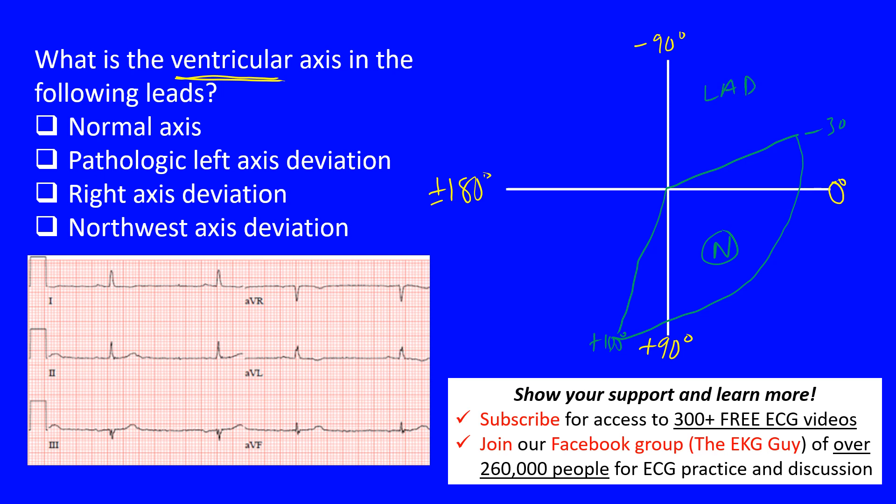If you're up in this region, we call this a left axis deviation or pathologic left axis deviation. Normal axis would be here, and this is the right axis deviation, which is the third answer choice. Up here is our northwest axis; you may also hear extreme axis deviation or right superior axis or no man's land. This is the pathological leftward axis deviation; this is more physiologic.